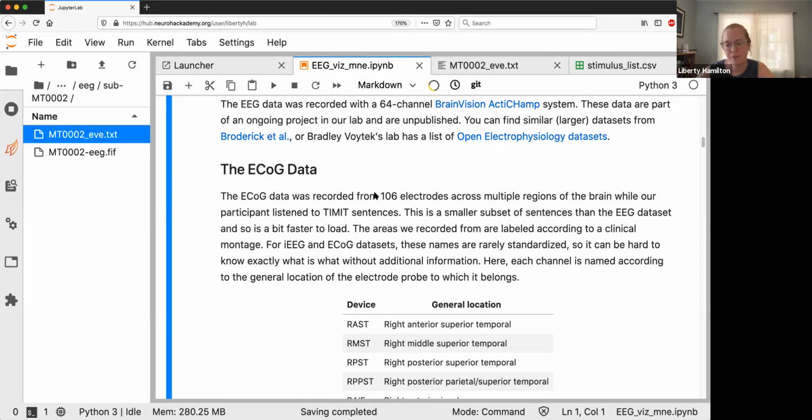But one of the downsides of those clinical systems is that, while they're amazing for recording clinical seizure-related data, for some of them it's not possible to synchronize an auditory or visual stimulus in an easy way. I think that's changing, and if others know about this, you can definitely let me know. Having additional analog ports for synchronizing stimuli is something that's typically there for research setups, and I haven't seen that as much in the clinical setting.